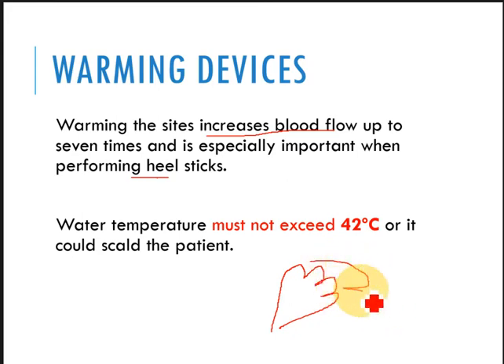Okay, oh my gosh. I usually hold the hand of the patient and I massage their hand, you know. I usually massage the fingertips to allow blood flow to happen.